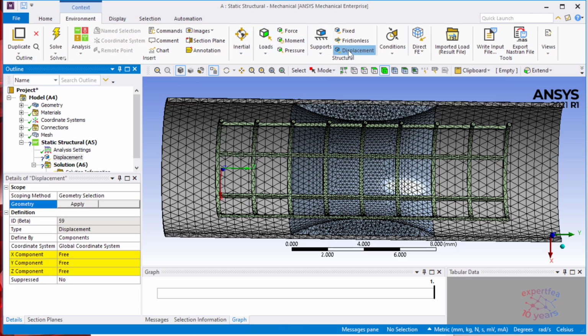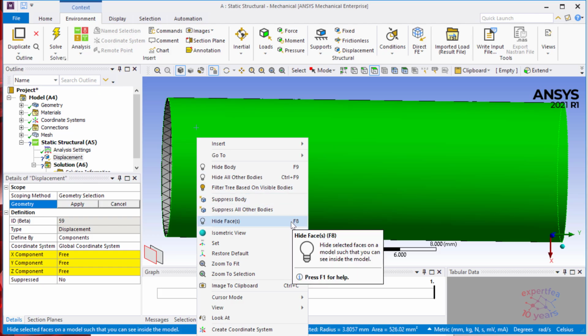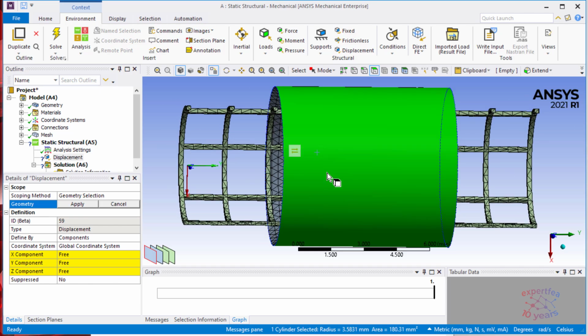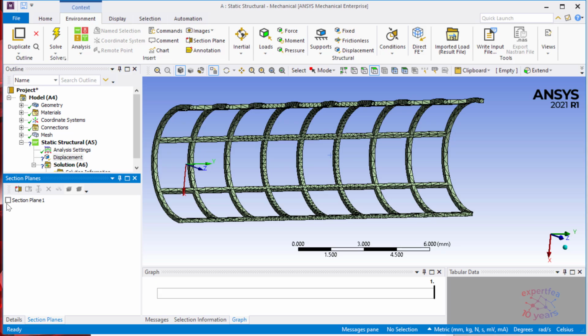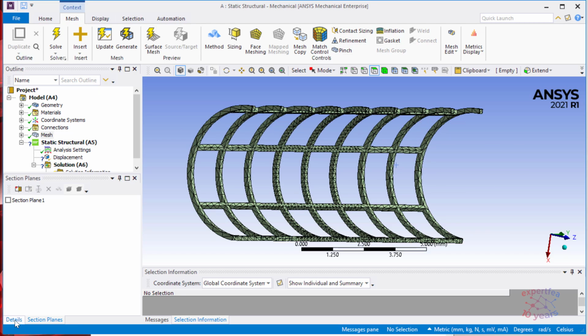So let's apply this displacement on the inner face of the stent. By the way, if you have bodies that kind of impede your vision, you can just press F9, or right click, hide face. I want to hide the body, F9. So we're interested in the... F9 to hide also, that does not work. Why should it work? You can get out of the section plane, just uncheck here. Oh, so I unchecked the section view and it doesn't show. Let's add another bug to the list.